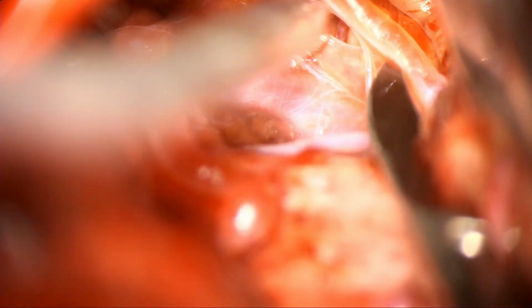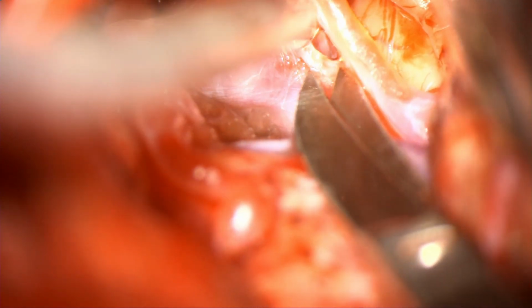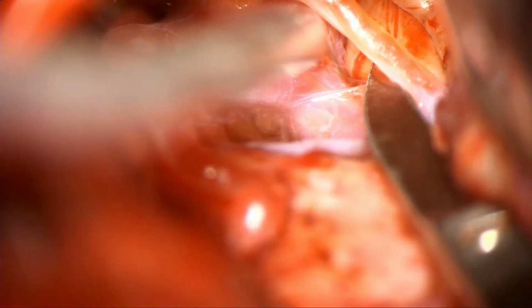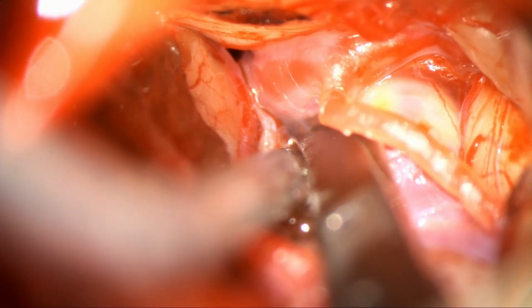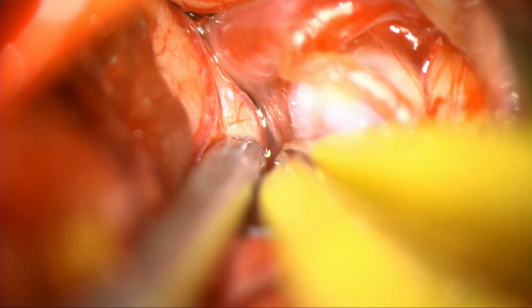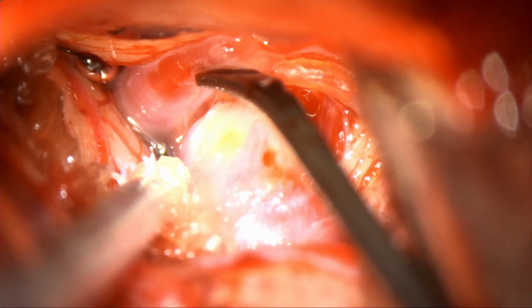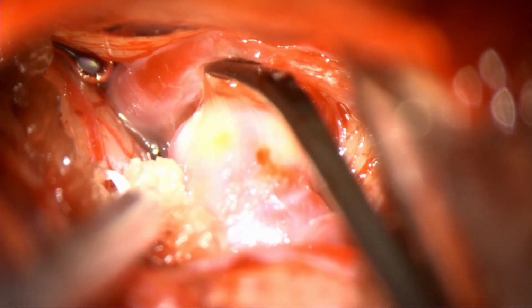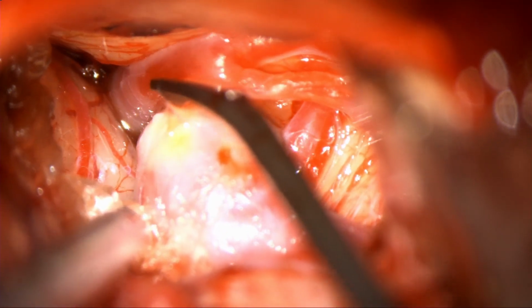Small branches of the anterior temporal artery are carefully separated, demonstrating once again tough arachnoidal bands that have to be sharply taken down. Once these are taken down, the vessel will be mobilized, and you can see this significant degree of spasm already from manipulation. Now we're dissecting around the aneurysm to confirm that it's separated from the temporal lobe and from the anterior temporal vessel. And once again, all the adhesions are taken down bluntly or sharply.